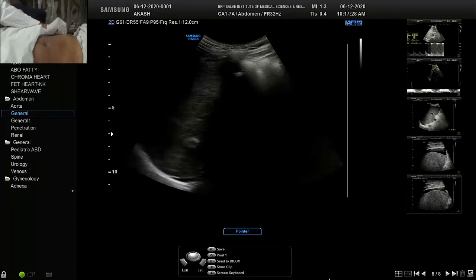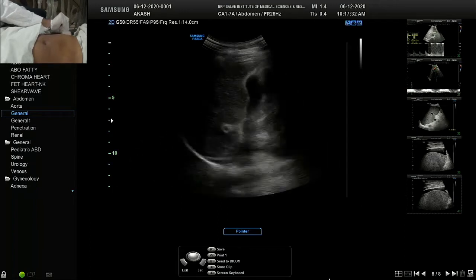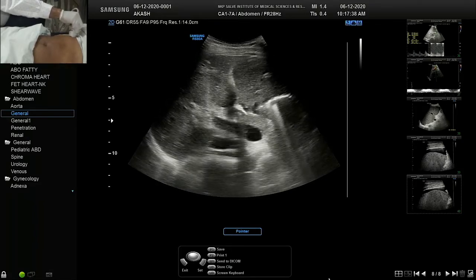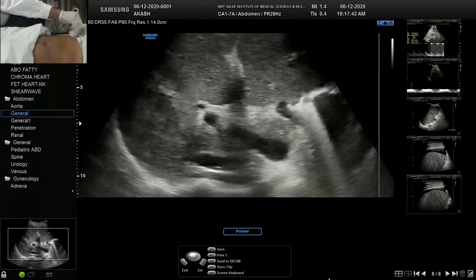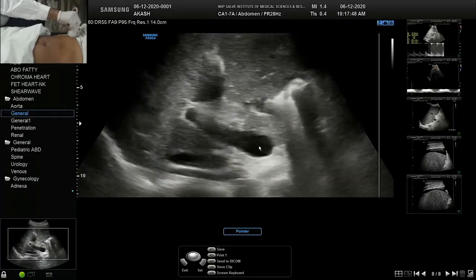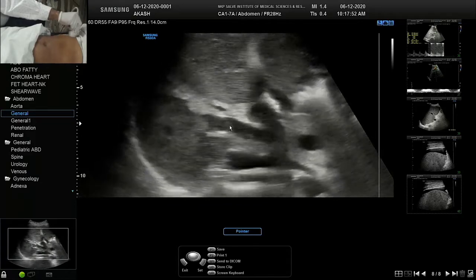Due to layering, the portal vein has a very slow flow, so there can be a visibility of blood while moving in the portal vein. See that, you can see it here. I will just magnify this for you. If you can appreciate here, that flow is seen, slow flow is seen. That is again an indicator of patency. You can see that slow flow here.